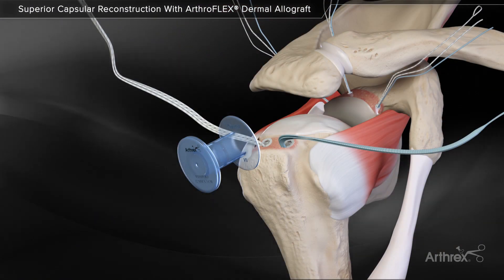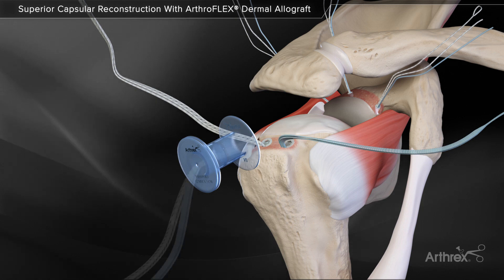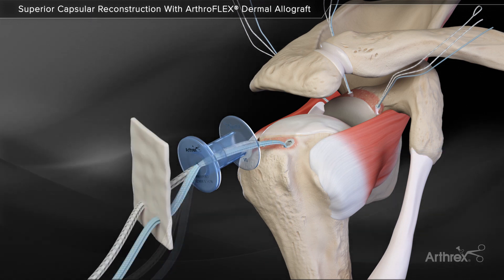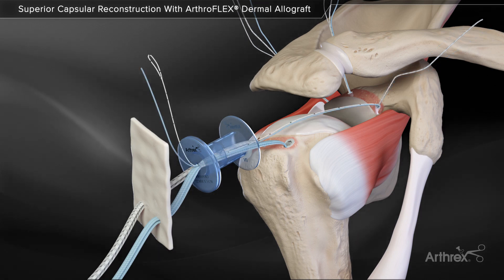A 12 mm passport cannula is used in the lateral portal to help with suture management and graft passage. Use a retriever to carefully pull the fiber tape sutures through the passport cannula and then through the graft. Retrieve the blue repair stitch and loop side of the white-black shuttle stitch from the anterior anchor.